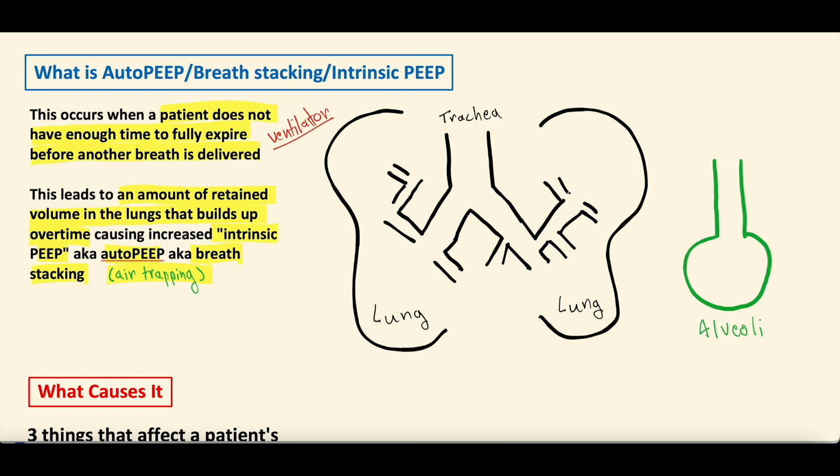But what we see with the breath being delivered by a ventilator is essentially, and there's some variability to this, right? There's volume control ventilation, where we set the amount of volume the patient gets. There's pressure control ventilation, where we set the amount of pressure a patient gets. For the sake of ease, all these concepts we're talking about, we're going to assume the patient is on a volume control mode of ventilation, where we set the amount of volume they're getting. And what that means is, let's just say we set the tidal volume, TV for tidal volume, at 400 cc's, or 400 milliliters of air.